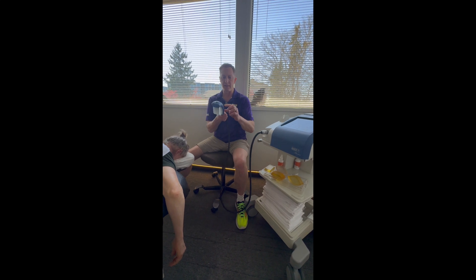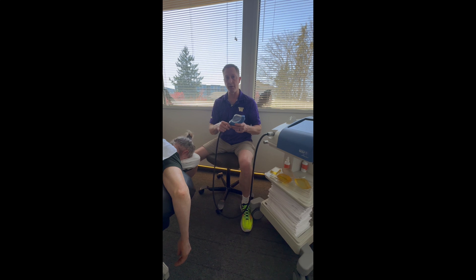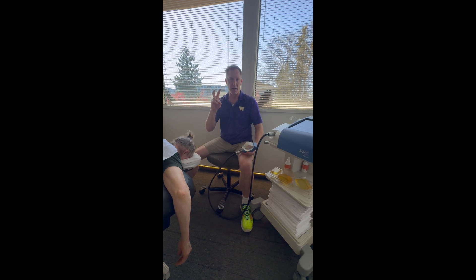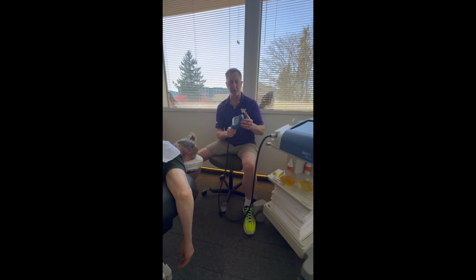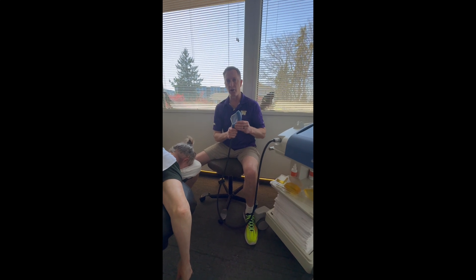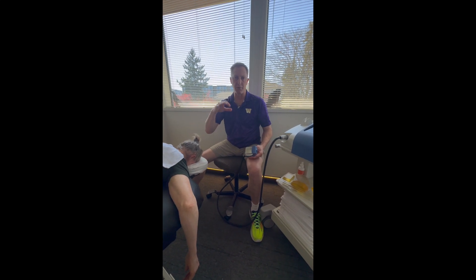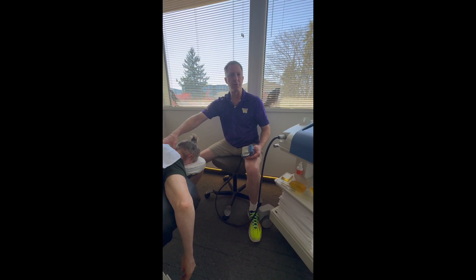This apparatus produces a sound wave. It's much lower frequency than the typical diagnostic ultrasound or therapeutic ultrasound you typically see in physical therapy — so this is not covered by insurance. But it does create a sound wave that's lower frequency, and whether that's electricity or sound, the lower the frequency, the deeper it goes.